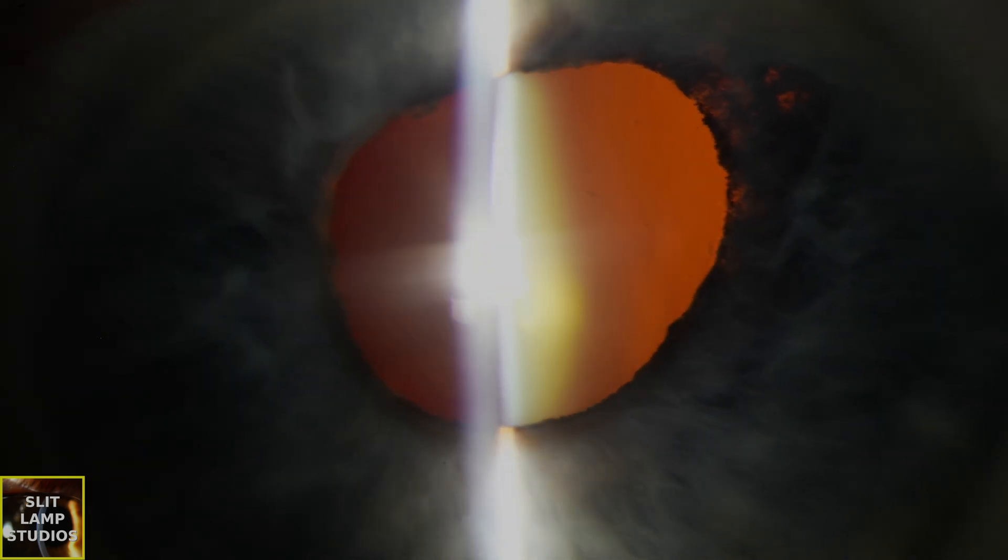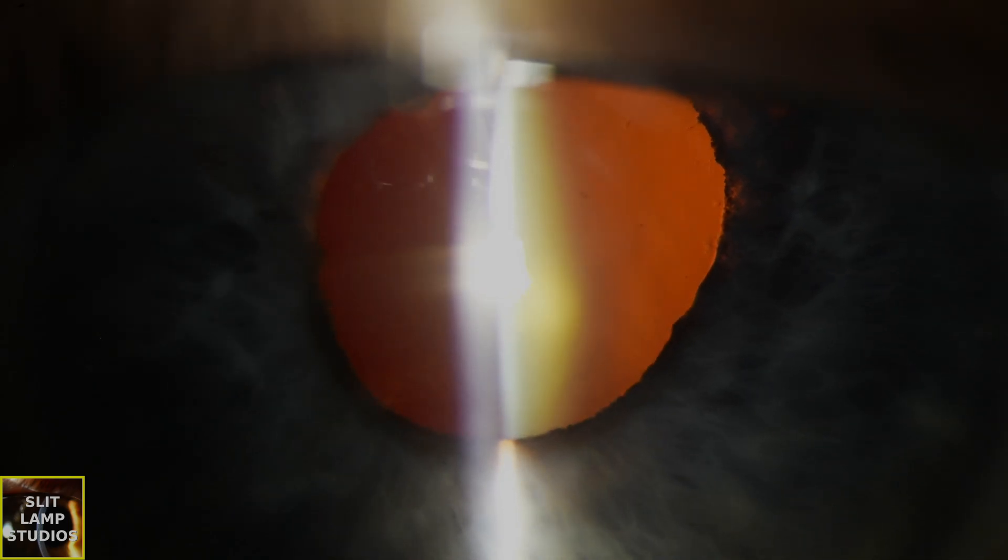If we look at the retroillumination, we can see that really moth-eaten appearance of the iris, that iris stromal atrophy superiorly there. And that's characteristic of herpetic infection.